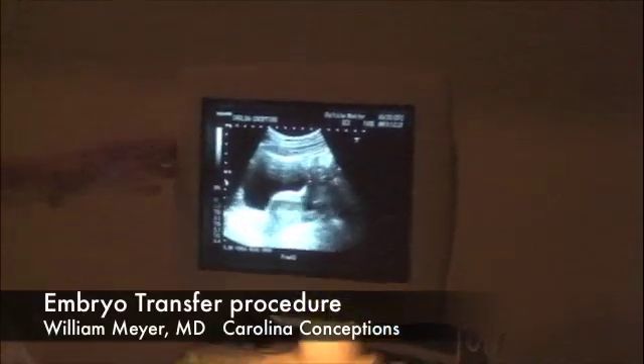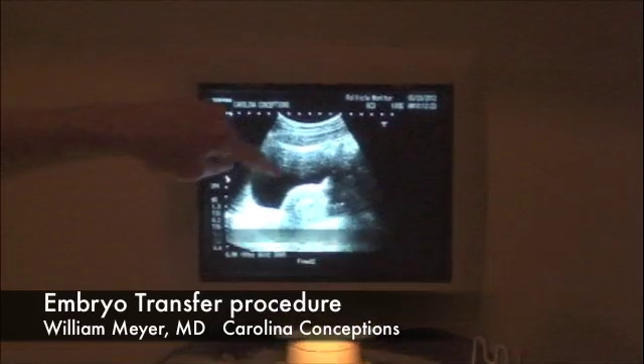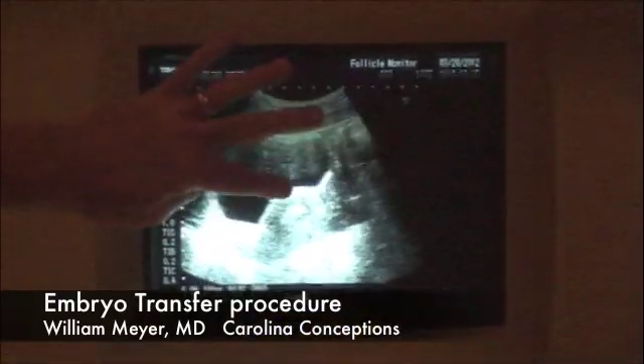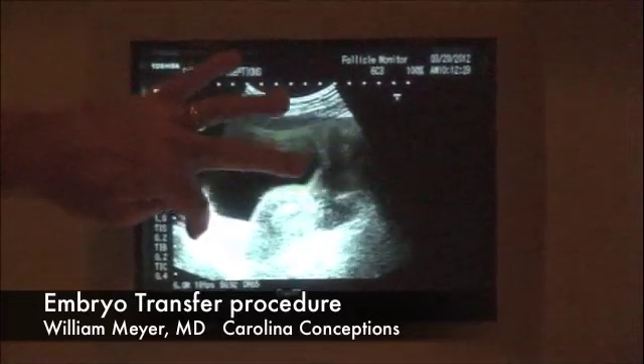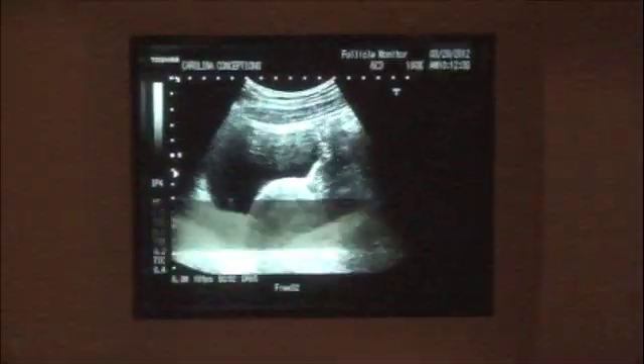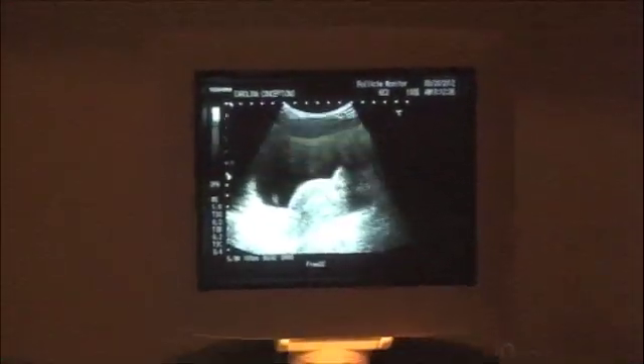Hi, this is Dr. Meyer, and we're here in the embryo transfer room. What I'm showing the patient is a photograph or an ultrasound of her uterus that you can see below the black structure, which is her bladder. We do this in all patients prior to transferring the embryos back inside their uterus. The patients come in with a full bladder — they're a little uncomfortable — but the full bladder allows us to see with an ultrasound down into her pelvis and see her uterine cavity.